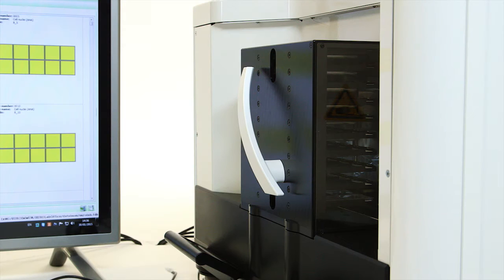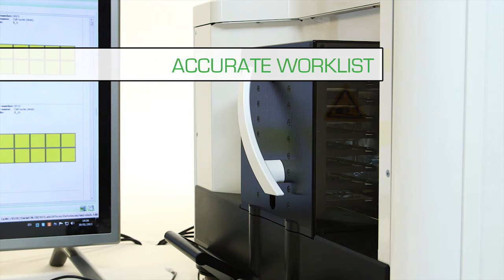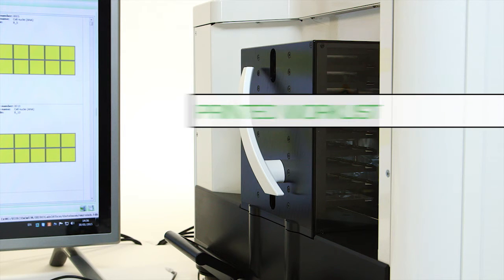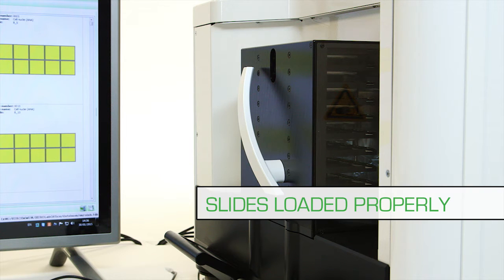Once the magazine is replaced onto the Europattern, the instrument will prompt you to confirm that the work list is accurate, the work list is printed, the correct magnification is selected and the slides are loaded in the magazine.